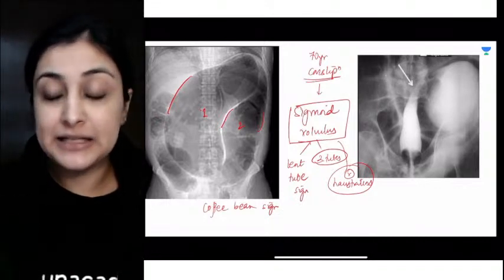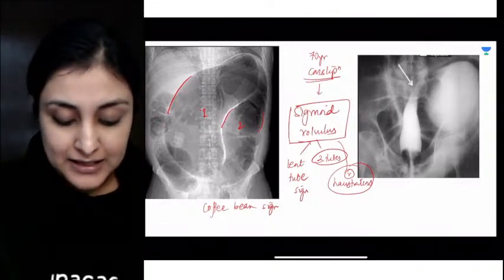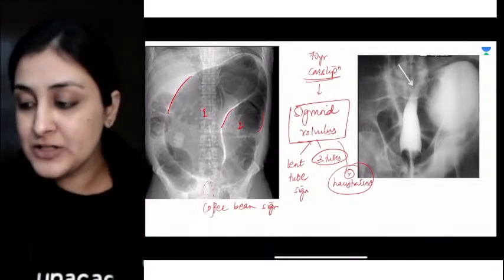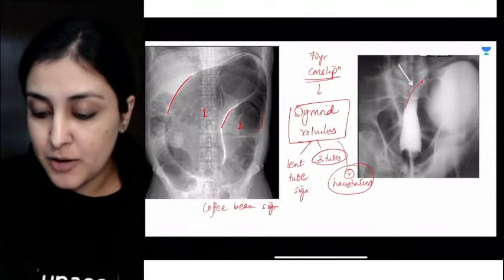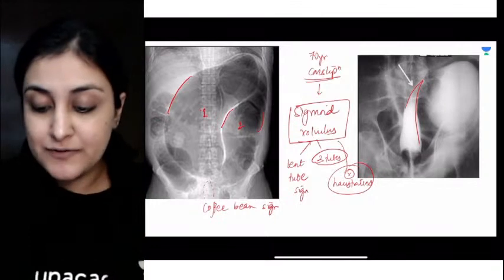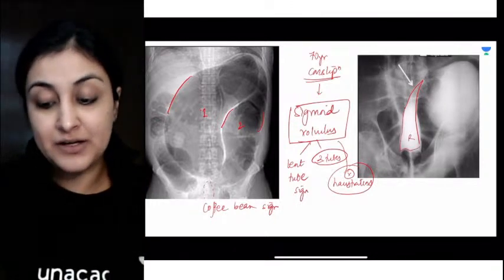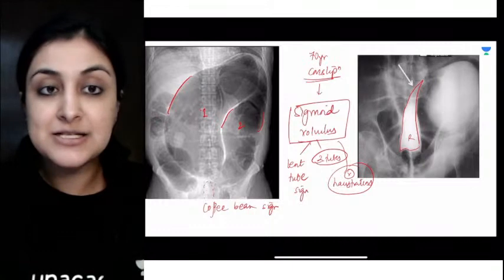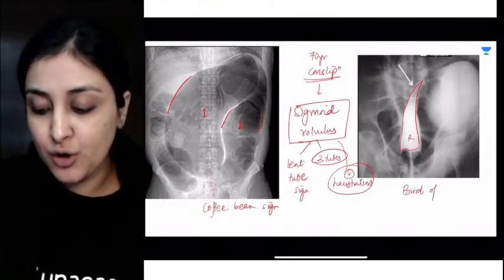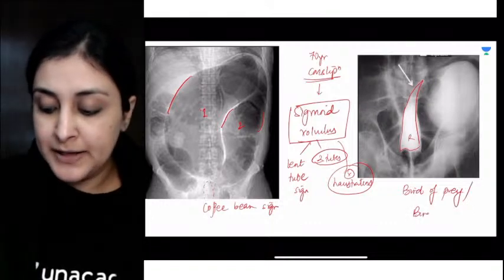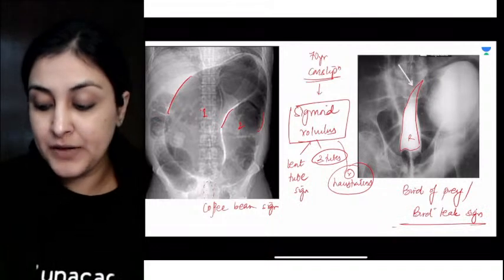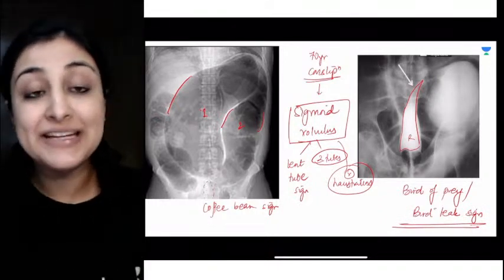This is coffee bean sigmoid volvulus. If we do a barium enema here, what will you see? From the rectum we'll put barium. Where there is volvulus happening, the barium will stop. The barium will stop like this because above this there is twisting. There is volvulus here. So we will see that there is tapering of rectum and proximal tapering at the point of volvulus. This is called bird of prey sign or bird beak sign. This is also a sign of sigmoid volvulus but on barium enema.